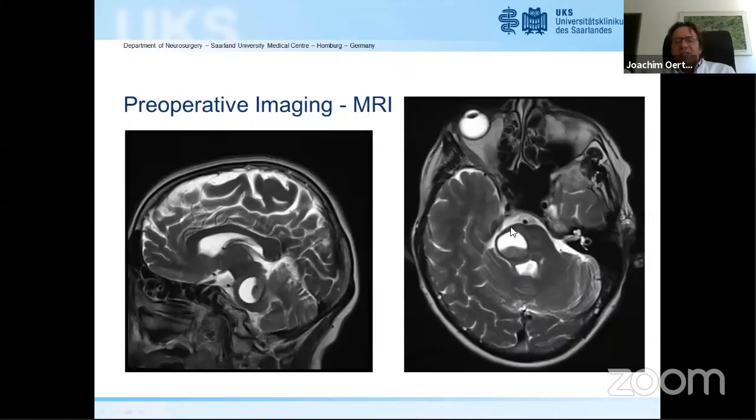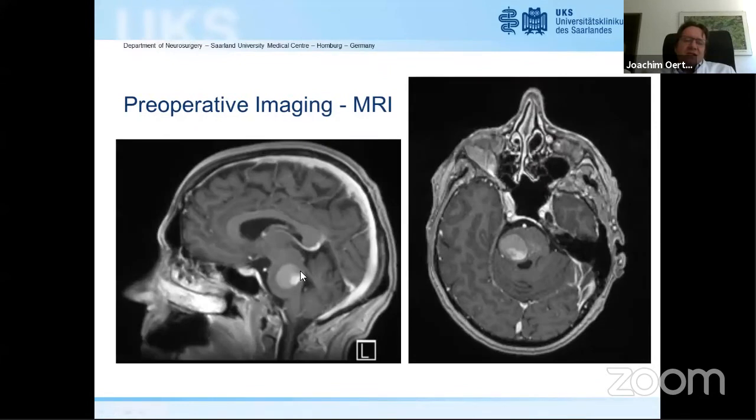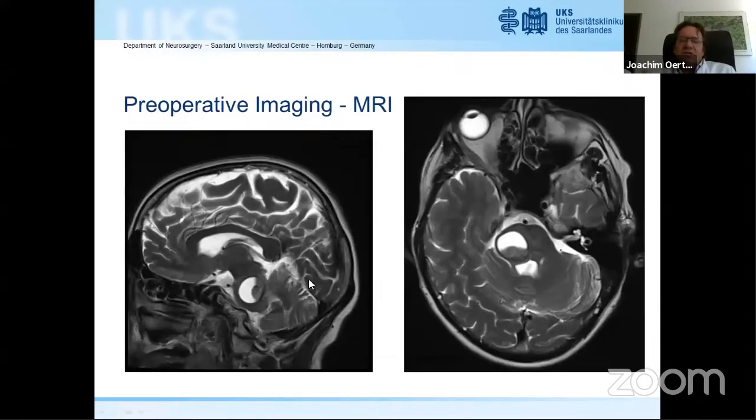Then we looked at this, which is a little bit against metastasis because she has no edema. And the hemangioblastoma nidus is usually sharply demarcated. It's not, but it doesn't matter much. What is in favor of doing the procedure now, even if you think it's not a metastasis, is that you have space for manipulation right now.